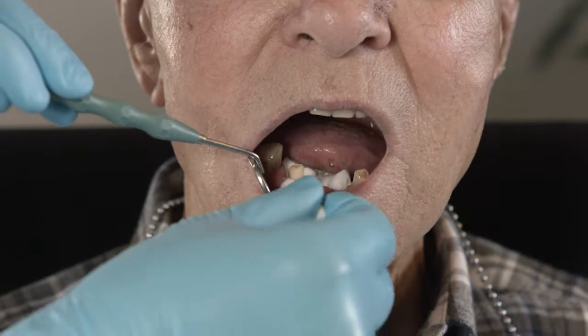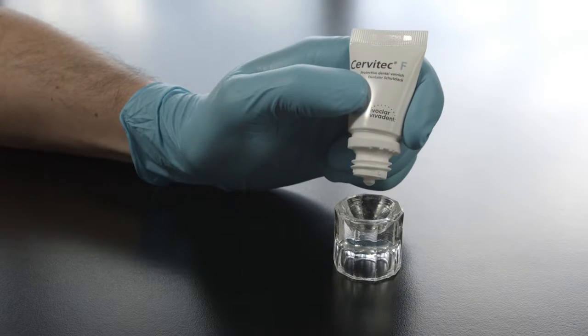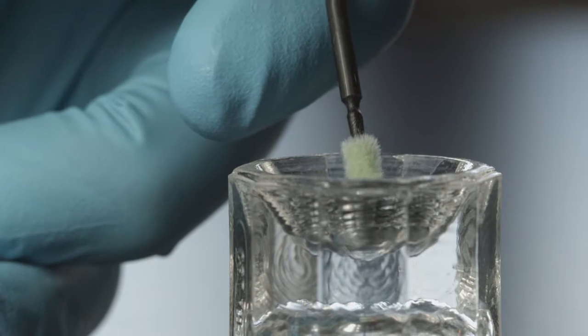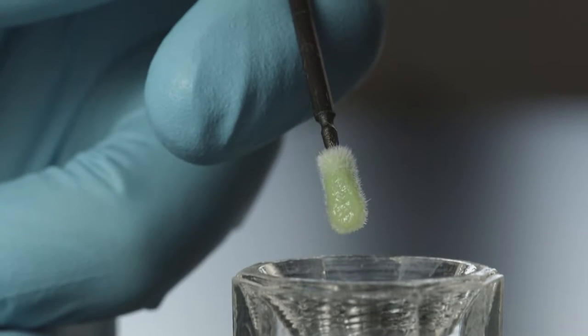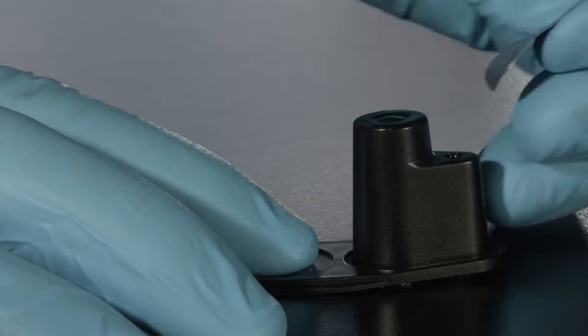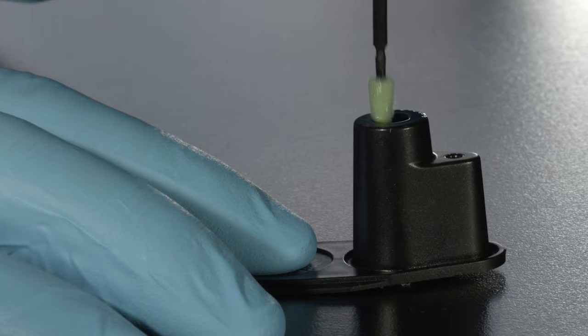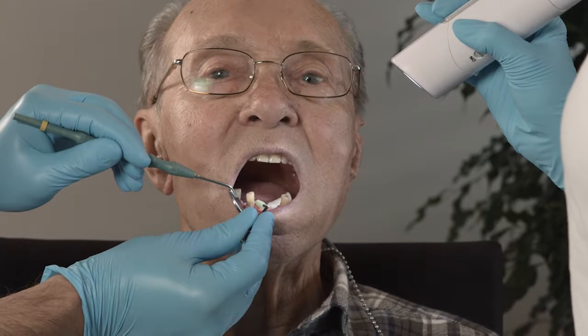Subsequently, the tooth surfaces need to be adequately isolated. Now remove the required quantity of varnish. Only use as much varnish as you really need to prevent excess material from drying out on the dappen dish. If you use a single dose unit, it is recommended that you briefly dip the applicator into the fluid once. The VivaBrush G applicator is especially suitable to apply the varnish. A fine layer of the moisture-tolerant varnish is sufficient for optimum basic protection.